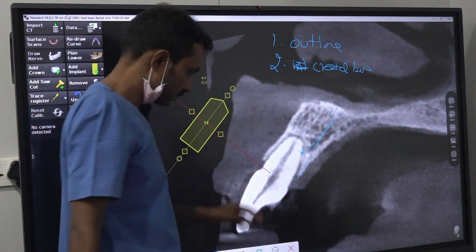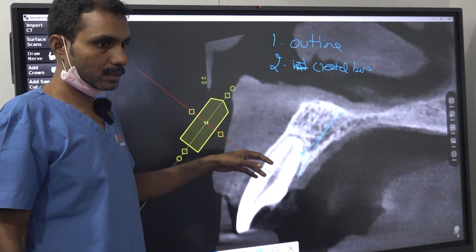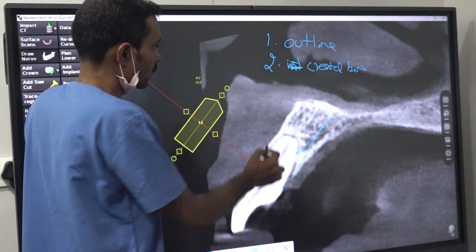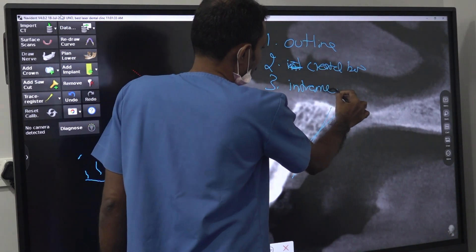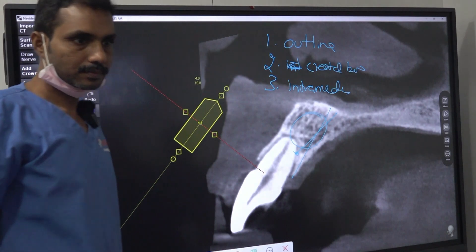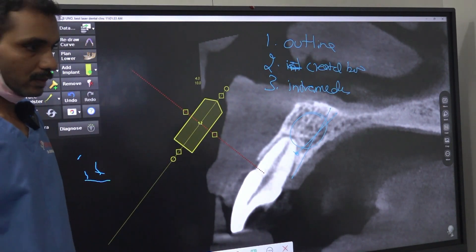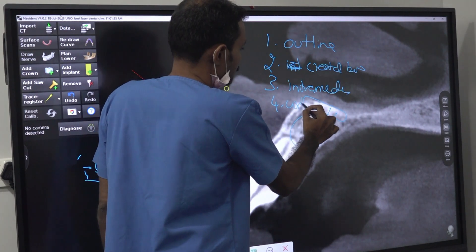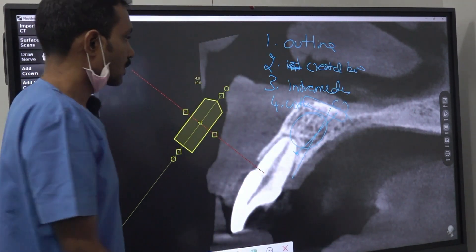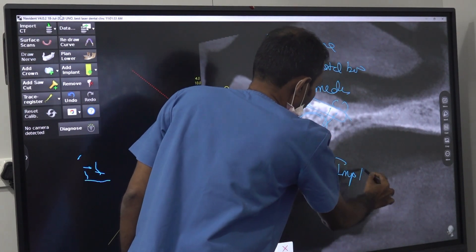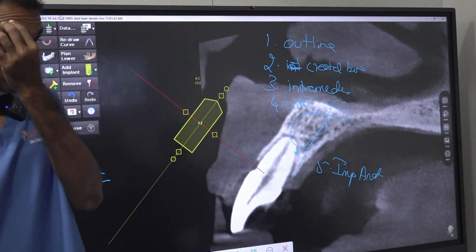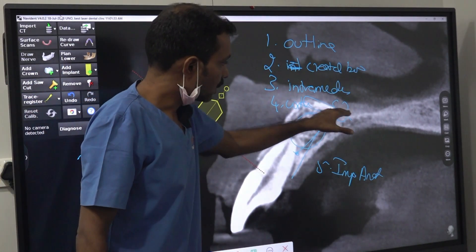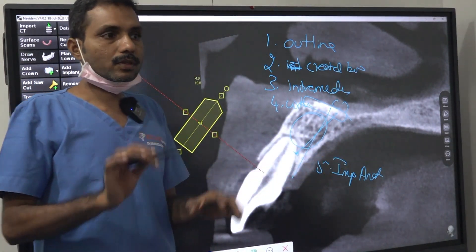When reading a CBCT, follow this checklist: First, crestal bone — in a healed area you can see the crestal bone, but if a tooth is present the crestal bone or labial plate may be infected or lost. Second, intramedullary bone — the bone inside. Third, the cortical bone. Fourth, any important anatomical structures. So the order is: outline, crestal bone, intramedullary bone, cortical bone, then important anatomical structures.